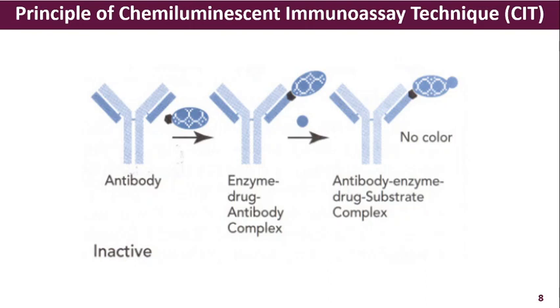Bright luminescence of the sample indicates the presence of abusive drugs or hormones or anabolic steroids under investigation, and no luminescence indicates that the sample is free of the drugs or abusive drugs, drug metabolites, hormones, and anabolic steroids. So this is how the investigation is done, and this is also a very simple investigation carried out in the solution form without multiple washings.